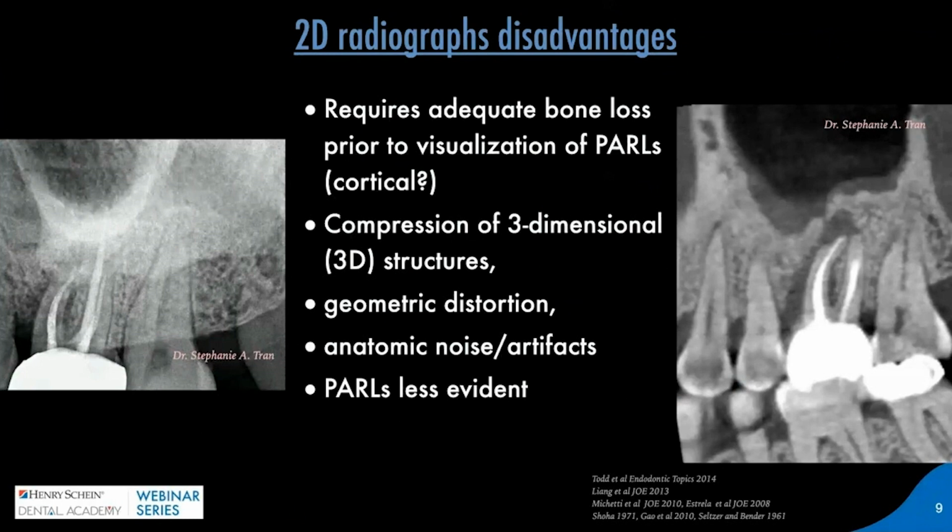Quite a few papers published in endodontics have determined that CBCTs are far superior when diagnosing periapical radiolucencies, which are more commonly seen and might be missed on a 2D radiograph. This is an important topic because there are times we want to evaluate exactly where the bone loss and radiolucencies are, and we might not be able to read them adequately on a 2D radiograph.